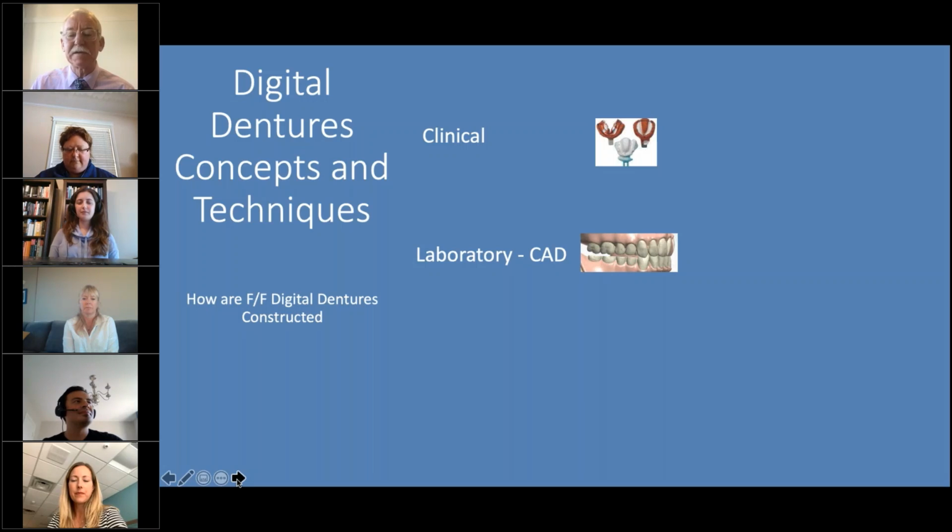And notice how Deborah has sliced off the lower posterior teeth. Then we can put some wax in there. That's sort of done through a copy technique, so we'll talk about that. The good thing about that technique is you can have a look at your 6 anteriors, the aesthetic zone. You can also slice the upper teeth off as well, like the lower, and put some wax rims on those.